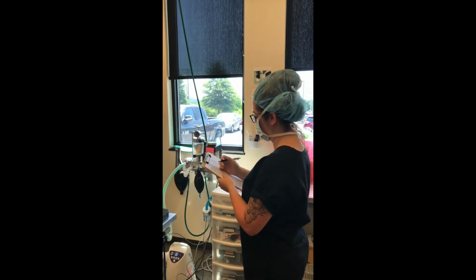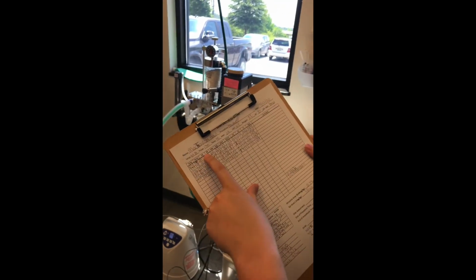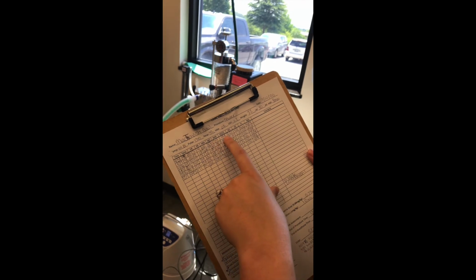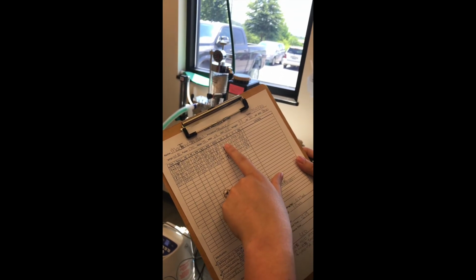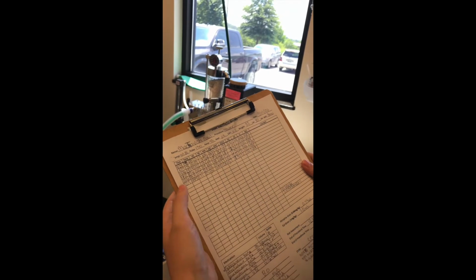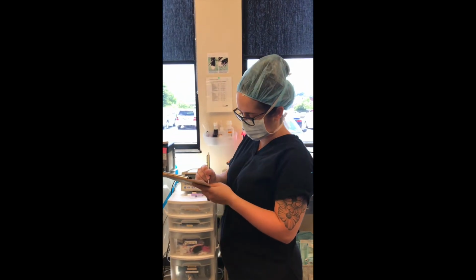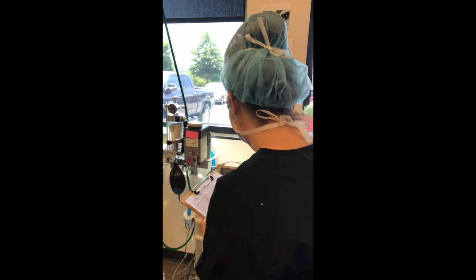I'm going to monitor this patient. We have temp, heart rate, respirate, mucous membranes, SpO2, and his blood pressure and EtCO2. We have the levels of his isoflurane and O2, and then fluids, and then his pain score. We try to do this about every 5 to 10 minutes. I'm using my watch. It's 12:17. It has been 5 minutes.